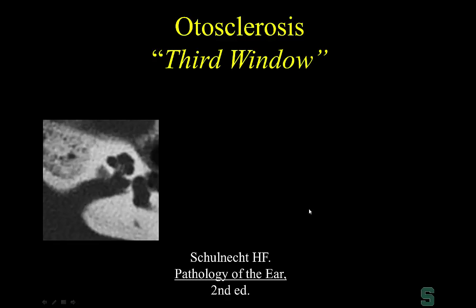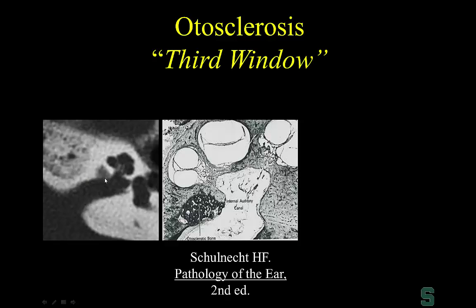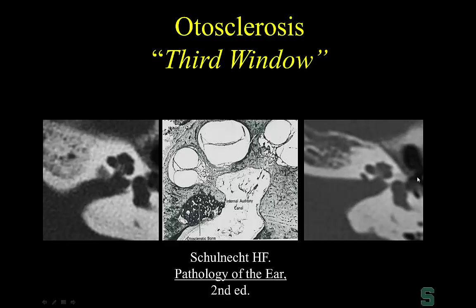A more recently recognized concept is the third window. On CT, you may not see classic otosclerosis at the fissula, but if you look at the internal auditory canal, sometimes you'll see smudginess of the bone or frank cavitation. This was actually described by Schuknecht in the 1950s. This is the third window — otosclerosis adjacent to the internal auditory canal. Otosclerosis can therefore involve the oval window fenestral, retrofenestral, or adjacent to the IAC.